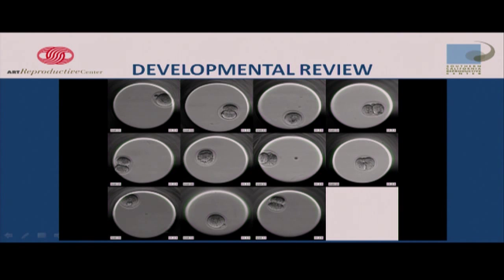So you can go ahead and start this one, Kevin. So this happens to be a set of 11 embryos that are in there. And we look at them all, and as they develop, there's the 2 moving along. Some of them are about to go to, come on, 4 cells. You want these things to keep going all the time. You're like, come on, I know you can do it. But we go backwards and forwards many, many times to look at them.